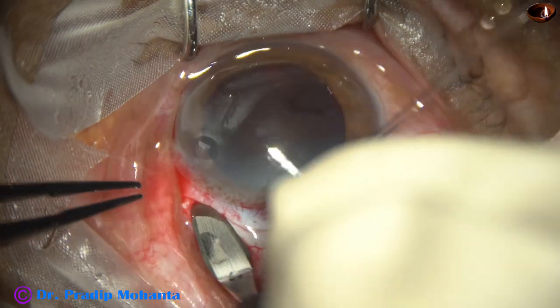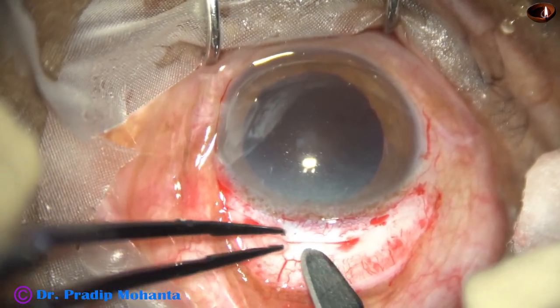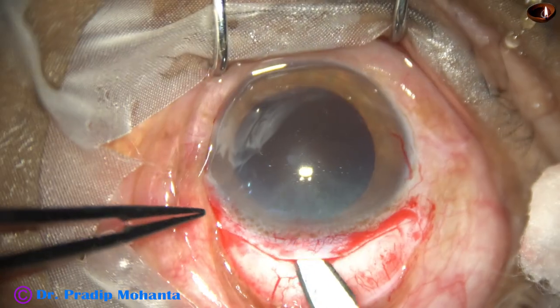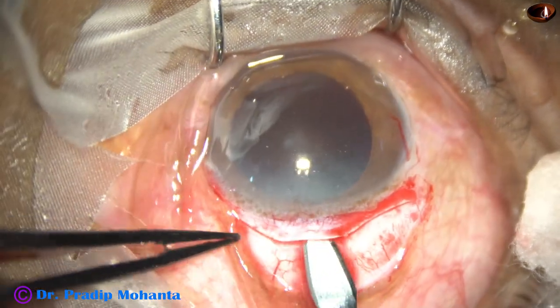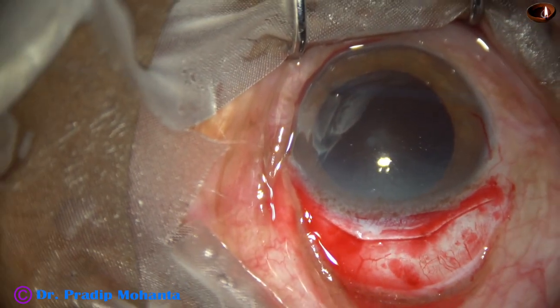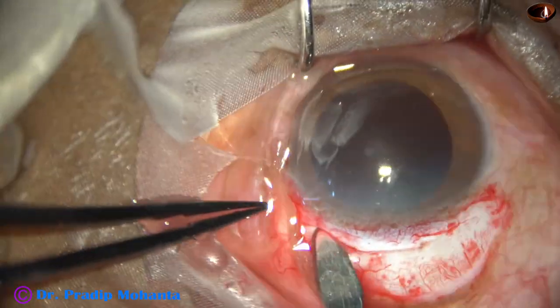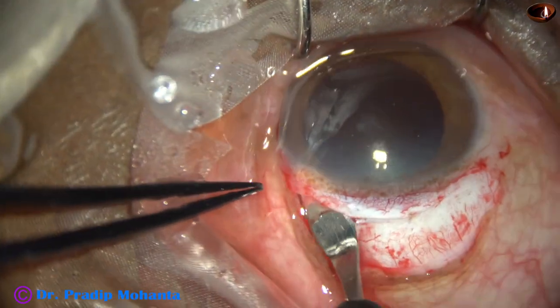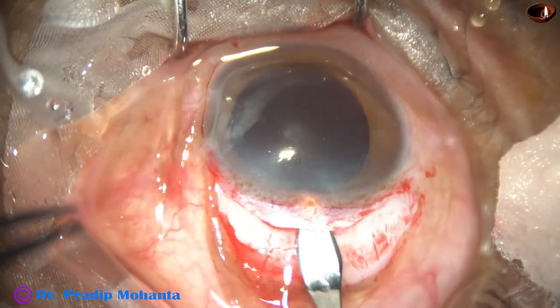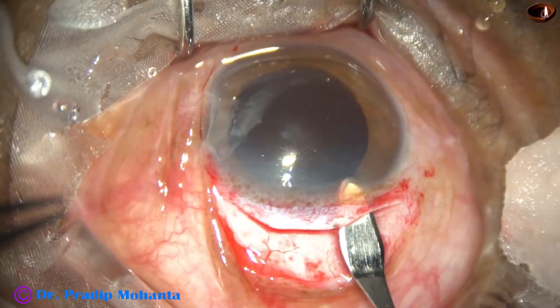This is a large incision, so I will call it ECCE, extracapsular cataract extraction, and since I am putting sutures, I will call it ECCE. But this is not the same ECCE that we used to do in the late 90s. So this can be called modified ECCE. I have taken some steps from SICS and some steps from ECCE. Like, we used to put sutures. So since we are going to put sutures in this large wound, it is ECCE, but not so many sutures as we used to put in conventional ECCE, where we used to make a large wound along the limbus.